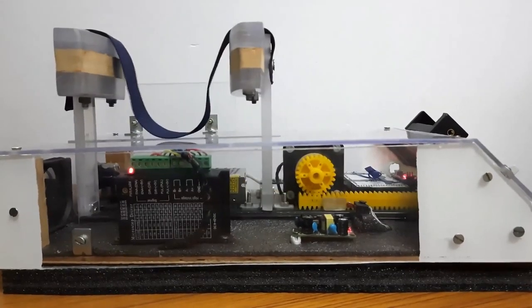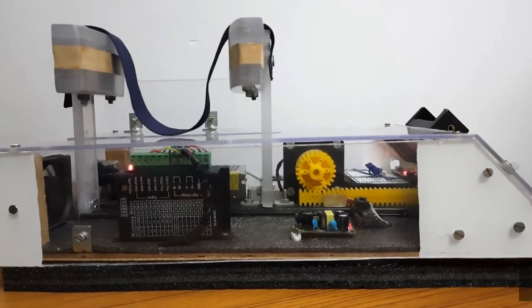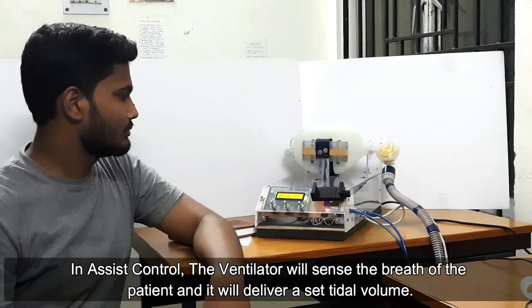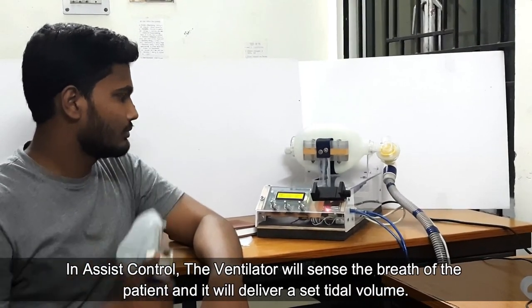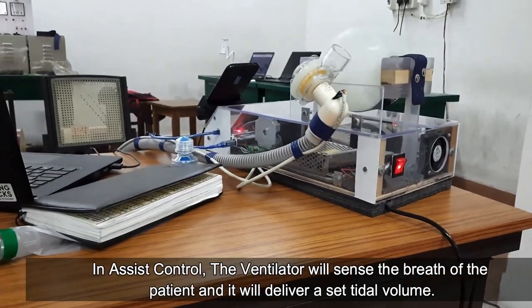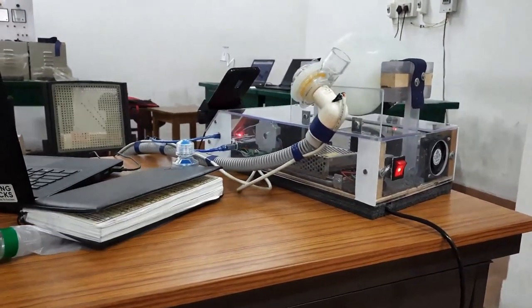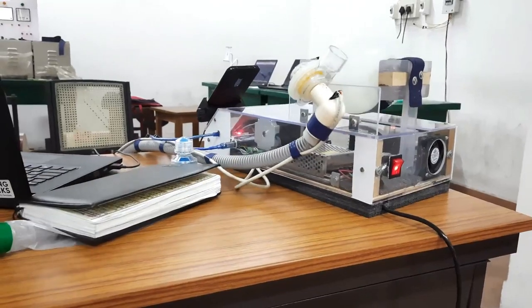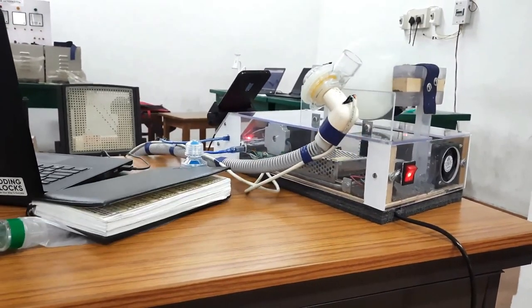There are two modes incorporated in our model: assist control and volume control. In assist control mode, the ventilator will deliver a fixed tidal volume at set intervals of time or when the patient initiates a breath. For this, two pressure sensors are attached to monitor the pressure, tidal volume, and the flow. In volume control mode, the ventilator will deliver a breath with preset tidal volume and constant flow.